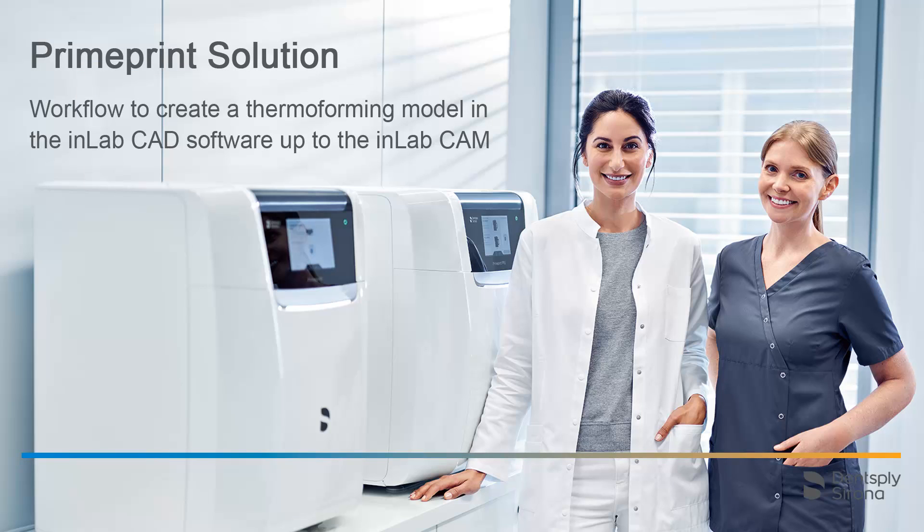Welcome to this video tutorial on the topic of PrimePrint solution. In this video, we will demonstrate the workflow to create a thermoforming model. We will guide you through the InLab CAD software and the InLab model app up to the InLab CAM software.